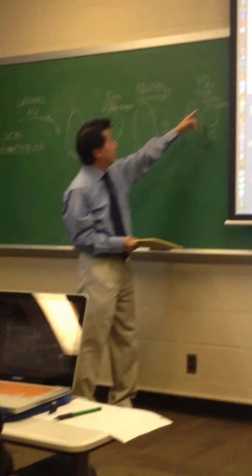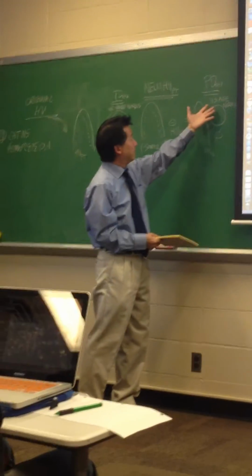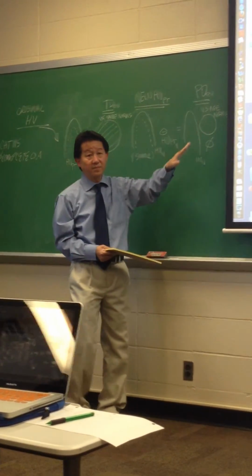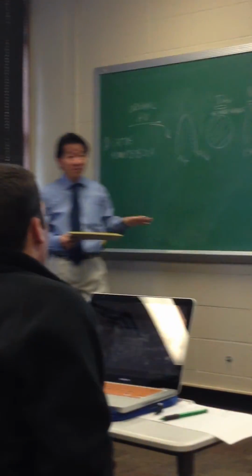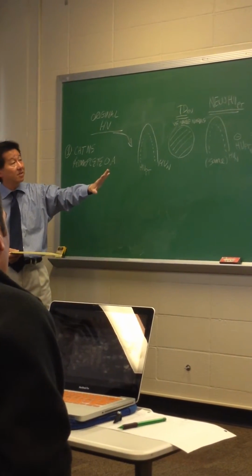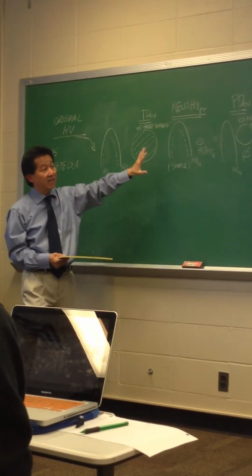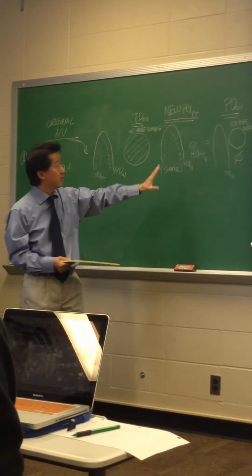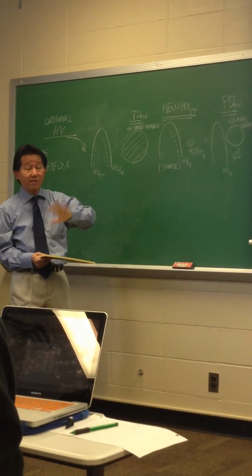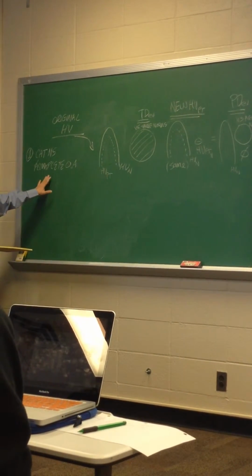And so now if you do that, you have zero difference, so you have a clear field, pattern deviation. This is your classic thing you're going to see with a cataract. If you get a field where total deviation shows a lot of loss, and then pattern deviation is clear, that person just has either a uniform cataract, most common case, or they might have something like this.